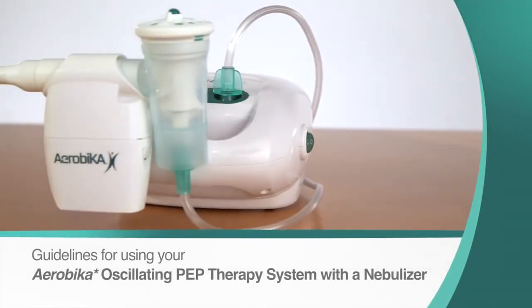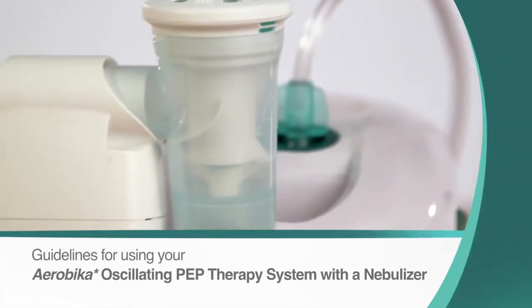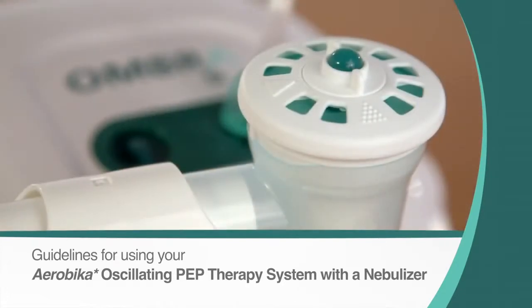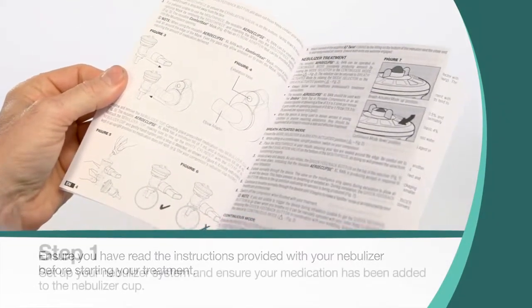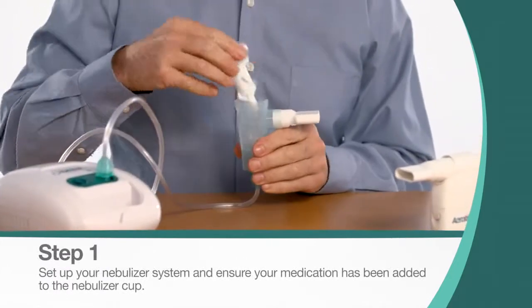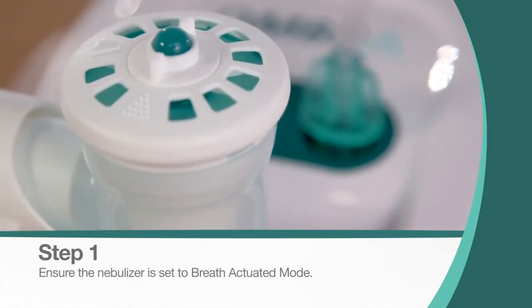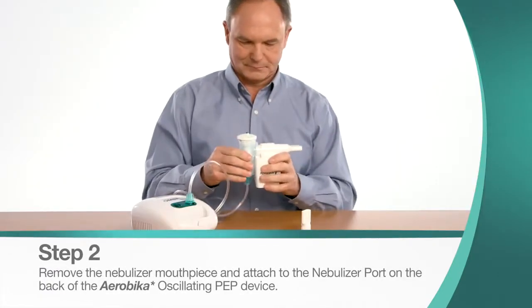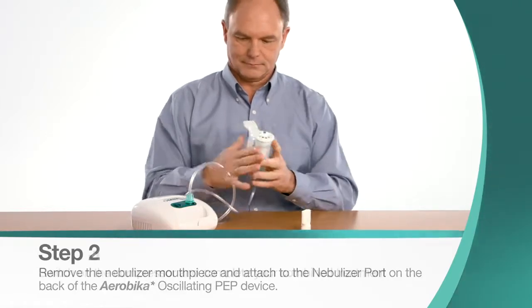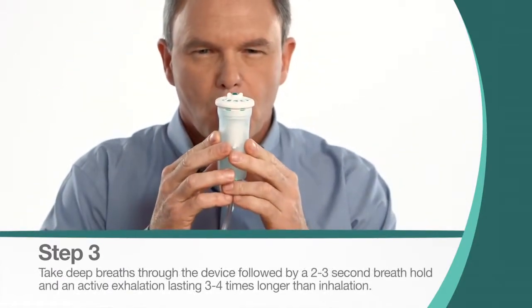Your Aerobica Oscillating PEP Therapy System can also be combined with your nebulizer treatment. We recommend the use of the AeroEclipse XL breath-actuated nebulizer and Ombra compressors. Ensure you have read the instructions provided with your nebulizer before starting your treatment. Set up your nebulizer and ensure your prescribed medication has been added to the nebulizer cup. Ensure the nebulizer is set to breath-actuated mode. Remove the mouthpiece from the nebulizer and attach it to the nebulizer port of the Aerobica Oscillating PEP device. Switch on the compressed air source and complete your combined treatment using the breathing technique from the previous section.